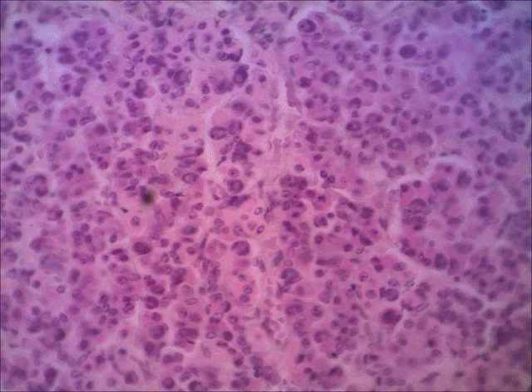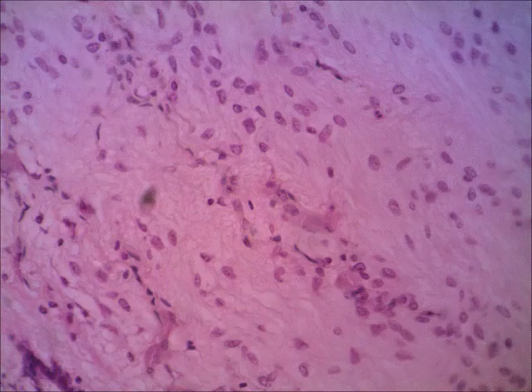All right, now in this next view, we're seeing a high magnification of the posterior lobe, and it's mostly just nervous tissue. So what you're seeing here, these light pink lines, are unmyelinated neurons, and then the nuclei you see are nuclei of some neuroglial cells. Remember, neuroglial cells are support cells. These happen to be called pituocytes, so that would be a pituocyte, that would be one, that would be one.